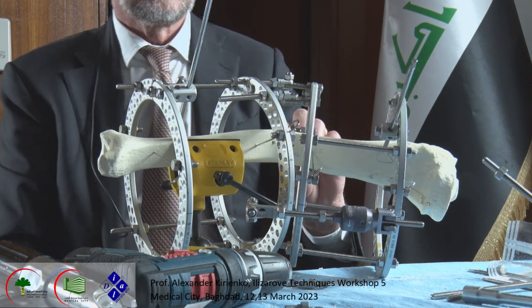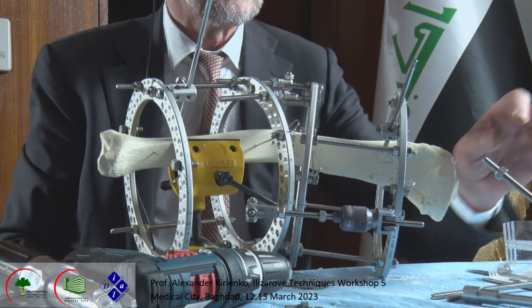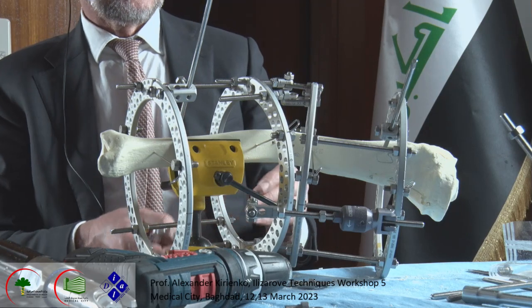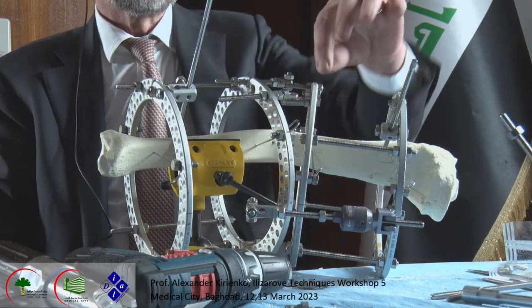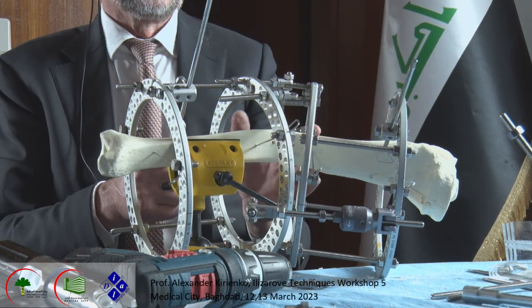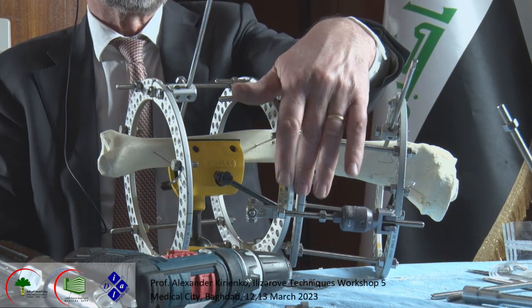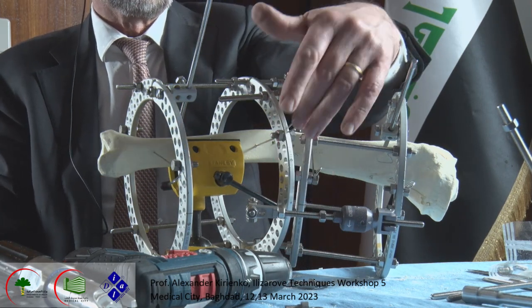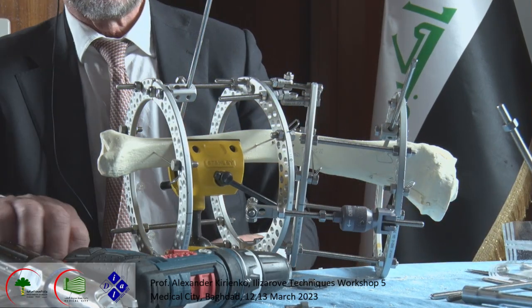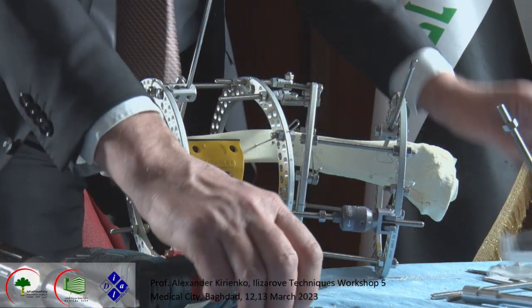this hinge is not so, how to say it, adaptable here, because we need to apply more force, which should be created on the medial side for correction of varus. If we do correction from the lateral side, on the medial side there is no power. And I show you later when we start doing correction. But only for understanding, I show you this system again.